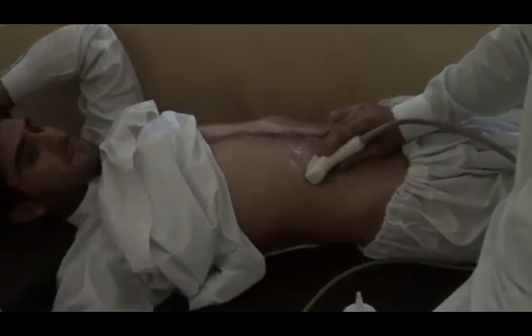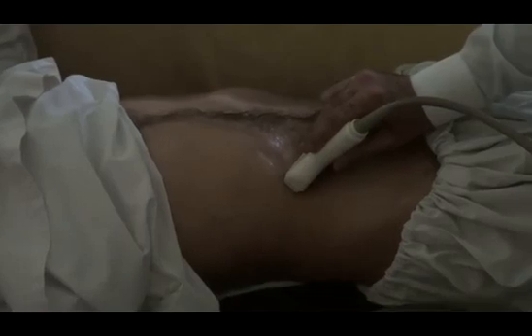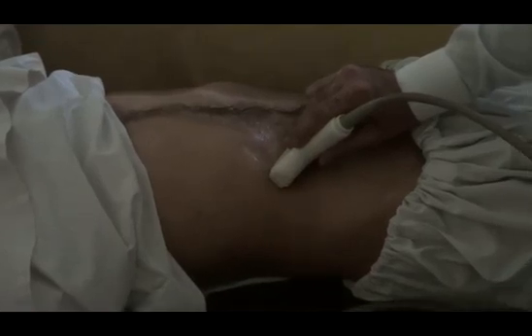From here I angle the probe towards the patient's left shoulder and ask the patient to take a deep breath to get the view. By just placing in this angle I am seeing only bowel gases and nothing else. So remember: this is the subcostal region, mid region — angle the probe, then ask the patient to take a deep breath and hold it.